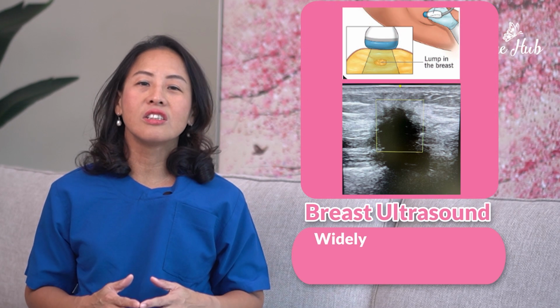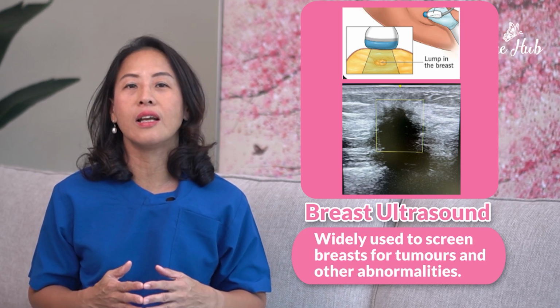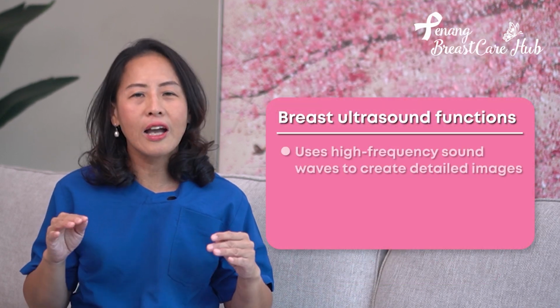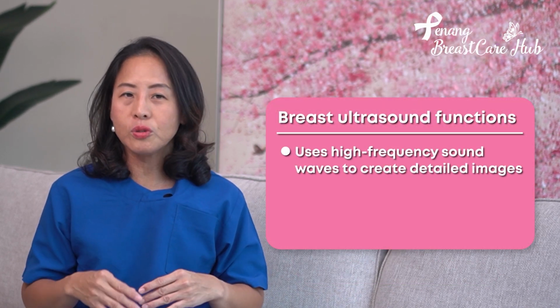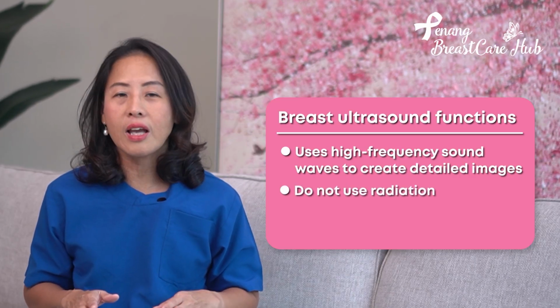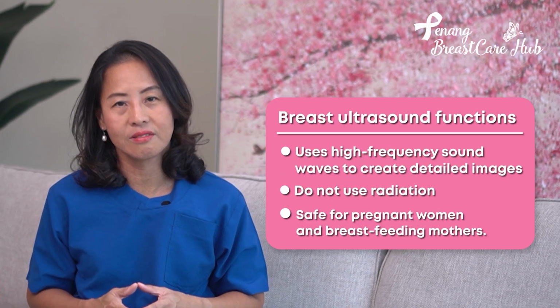Breast ultrasound is another common imaging technique used to screen breasts for tumors and other abnormalities. Ultrasound uses high-frequency sound waves to produce detailed images of the breasts. They do not use radiation and are generally safe for pregnant women or breastfeeding mothers.